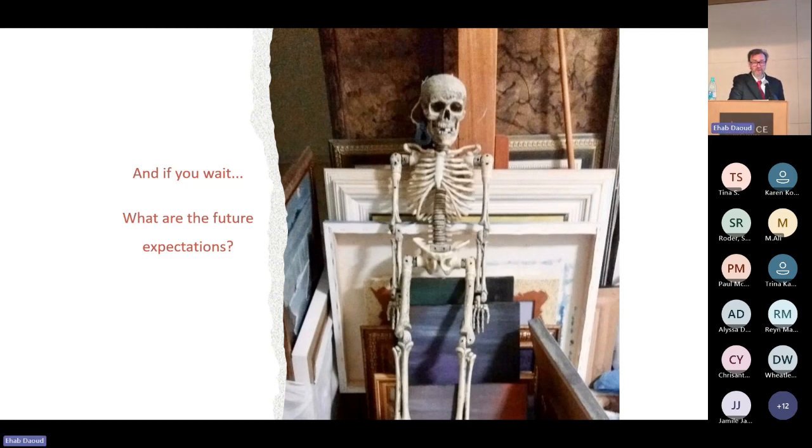Mechanical power is very recent and its research is mostly experimental or based on its correlations with results. Therefore, we still do not know for sure the amount and time needed for the energy delivered by the ventilator to the pulmonary system to cause injuries, and that these also depend on lung condition.